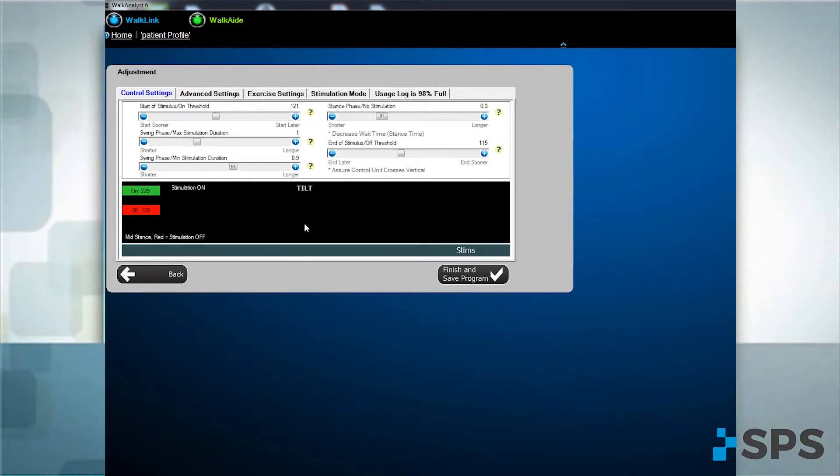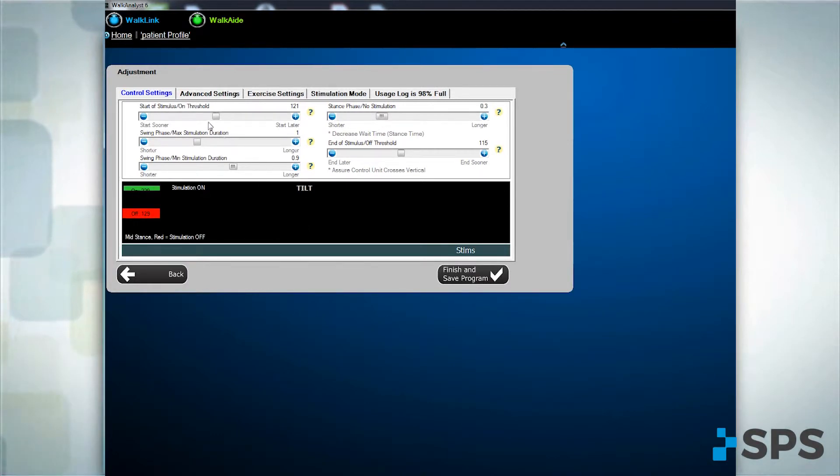Initiation. If the stimulation starts at the wrong time, change the start of stimulus.